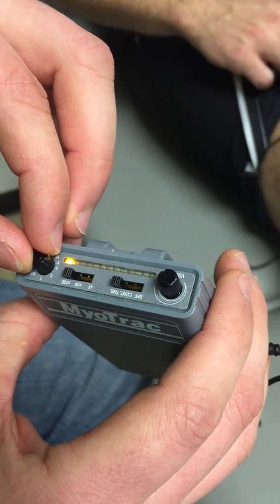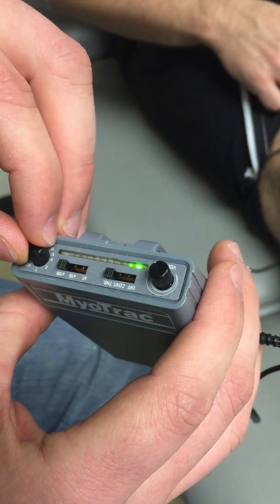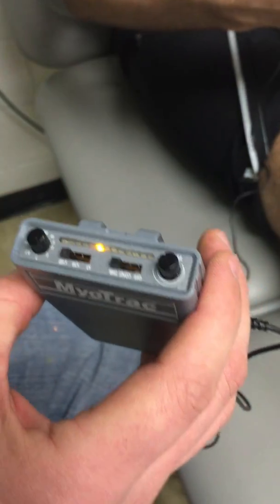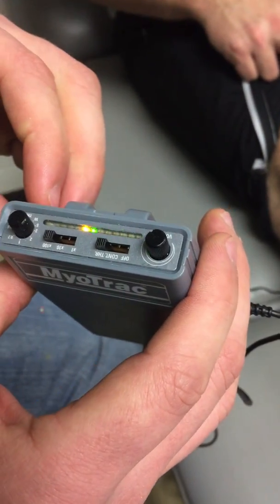Maybe he's not that strong today. We're going to turn that down and go again. He got weaker today, so we're going to go down to 200. Go ahead and contract.